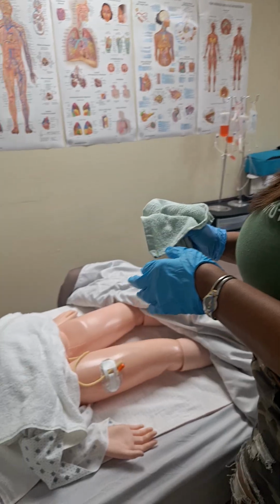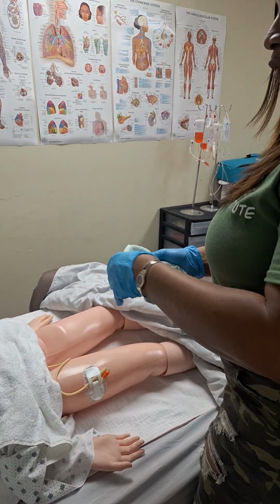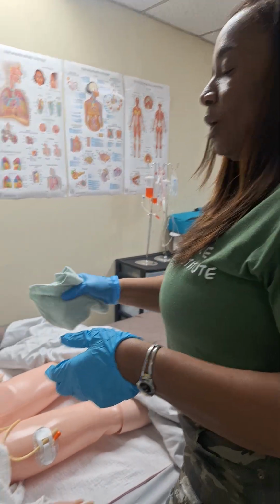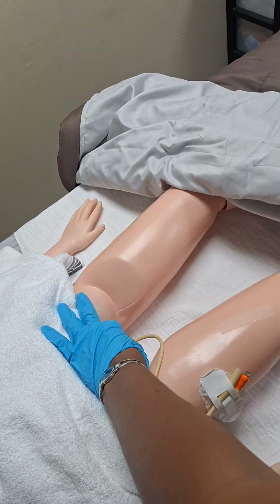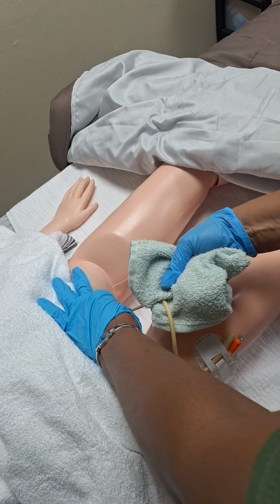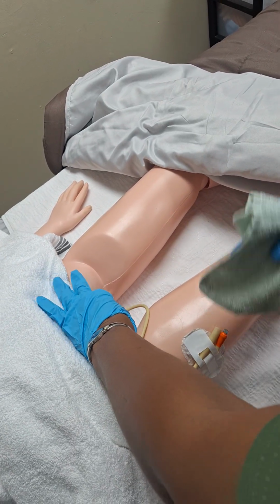So Miss Allen, I'm going to clean your catheter. I'm going to fold the other ones back. I'm going to use my 2 fingers so that I can curl it around the whole catheter. So I'm going to grab it at the tip of the meatus, and then I'm going to take my towel and go 3 to 4 inches down. And you're going to tell your proctor without tugging, I washed it once.